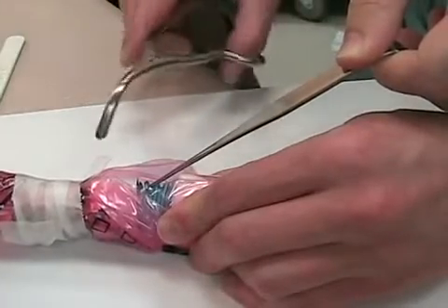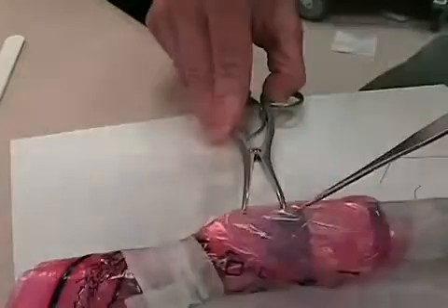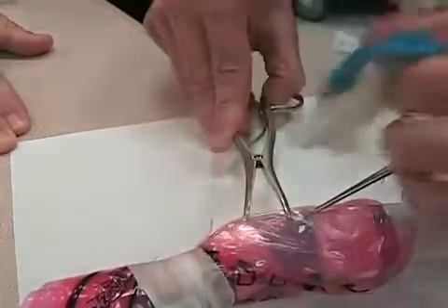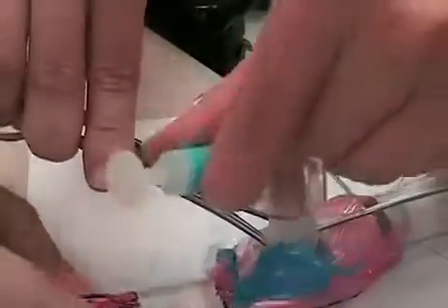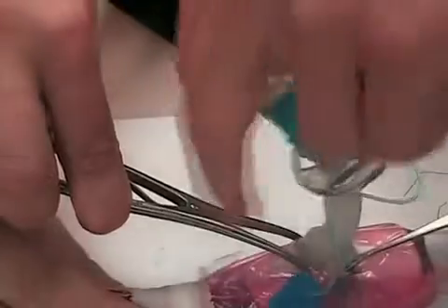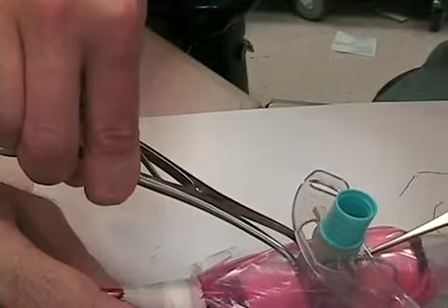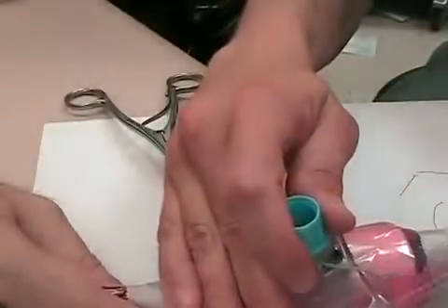The next step is the dilator. The dilator wants to open up the trachea vertically, not horizontally — vertically. Pop that in and open. Preferably grab a trach, the smallest trach you can find, because it'll be much easier to secure. Go in towards the trousseau dilator from the side — not straight in. Your trousseau dilator and the trach rotate in one motion so the trousseau is now facing down towards the patient's feet, and only then do you advance into the trachea. Once you're in, inflate your balloon and confirm with end-tidal CO2. Once confirmed, gently take out the trousseau and gently remove the hook. You're golden.